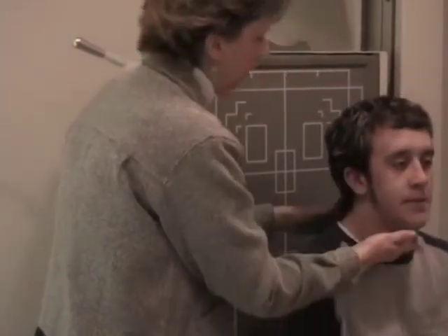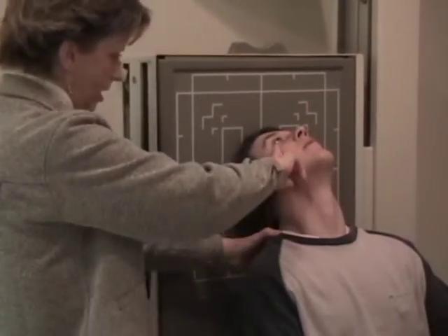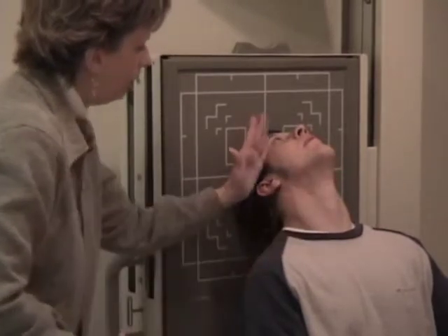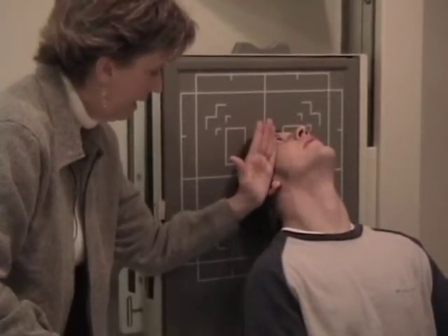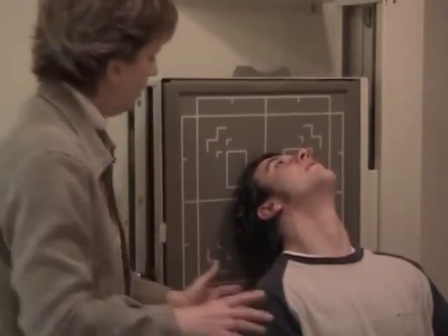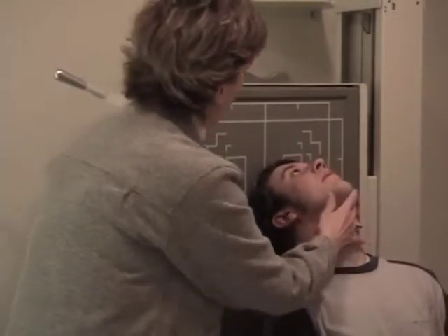We're going to have the patient hold the table, lean their head back, just like you did for the SMV, infraorbital meatal line parallel. That will take the zygoma and get it parallel to the film. I think you can see the advantage of that. And now if I'm going to only go after one, I'm going to offset him a little bit, and I'll do this side first.